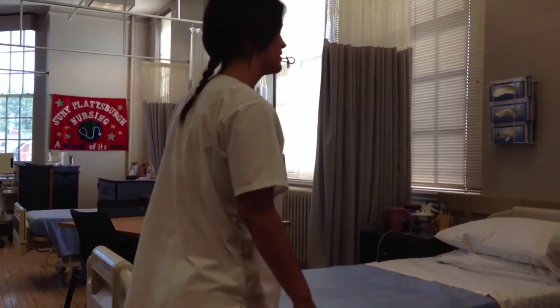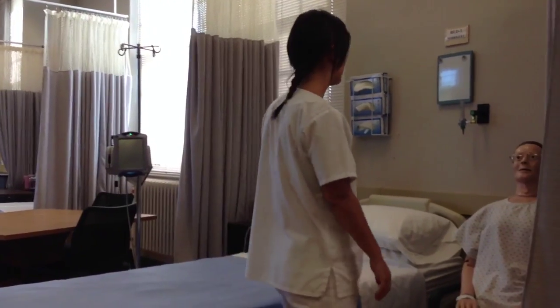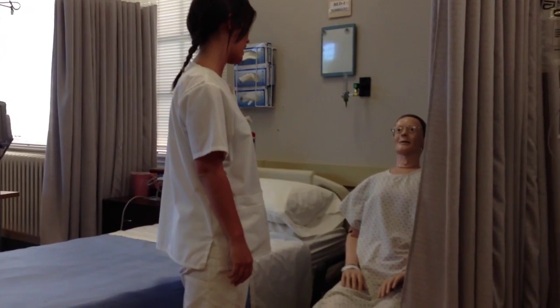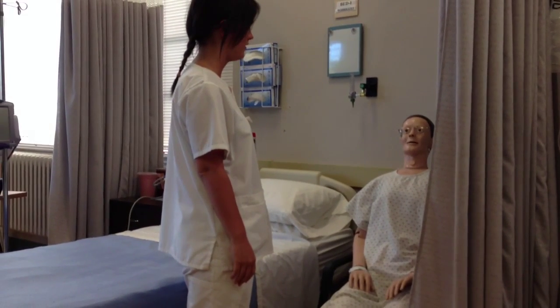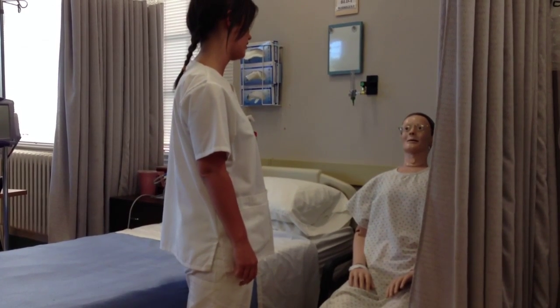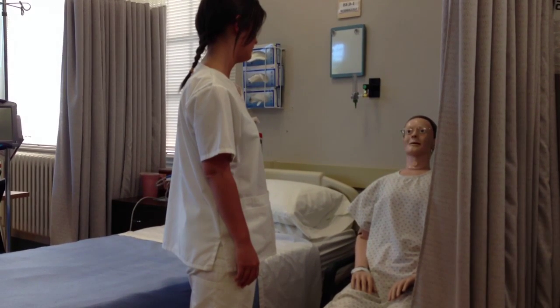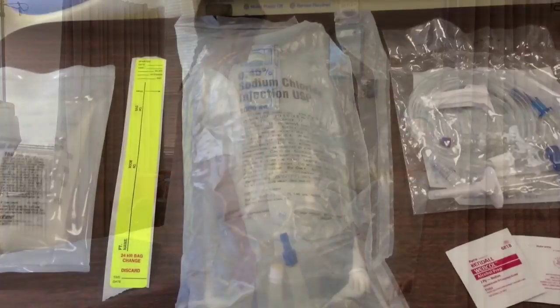The first thing you're going to want to do is introduce yourself to your patient. Make sure they understand why you're there and what you're going to be administering. If they've never had the medication before, or if they have any questions about the medication or its administration, make sure you answer them openly and honestly.